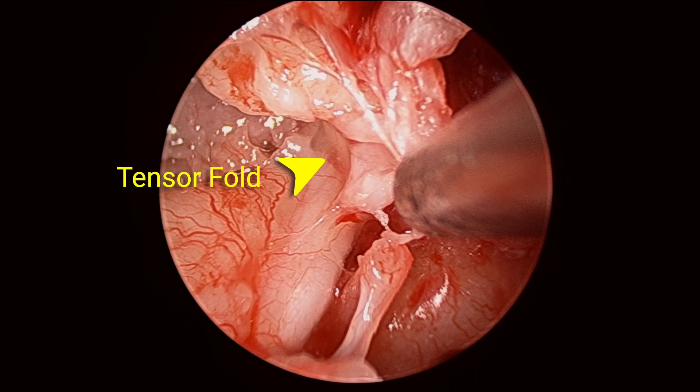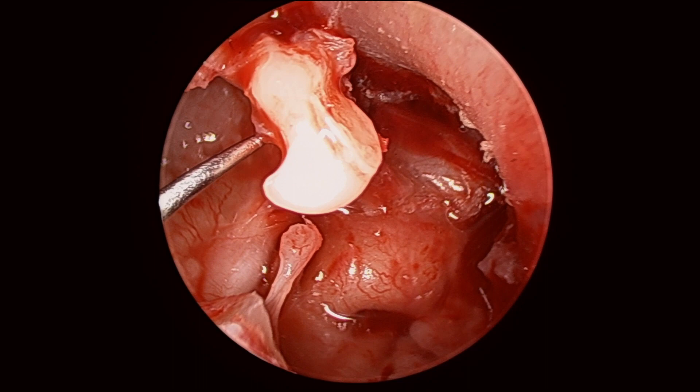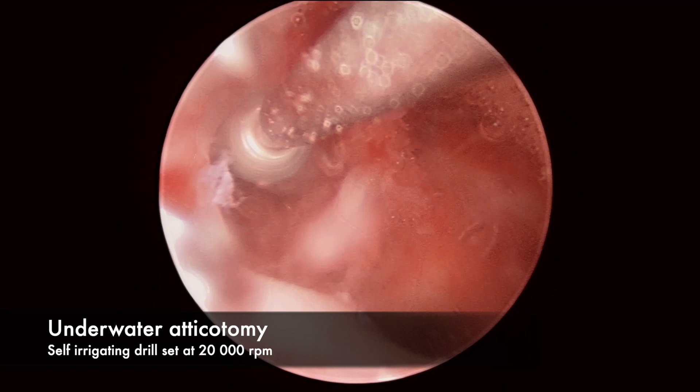The malleus head nipper is used to remove the head of the malleus, and then to get slightly better access to the superior aspect of the tensor fold, an endoscopic atticotomy is performed to allow instrument access superiorly to the tensor fold.